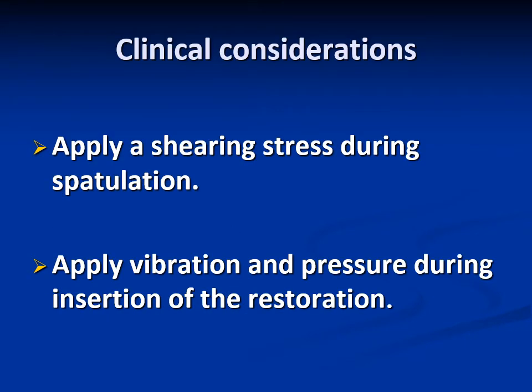So the clinical consideration with the use of polycarboxylate cement is to apply shear stresses during spatulation and apply vibration during insertion of the restoration. During insertion of the restoration, we can make some vibration to seat the crown, and this helps to reduce the viscosity more.